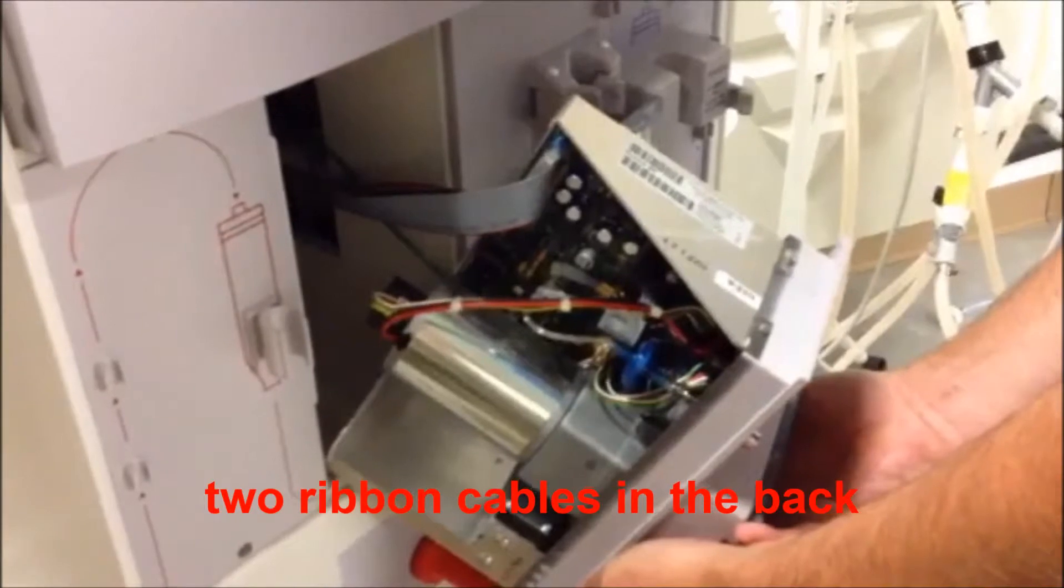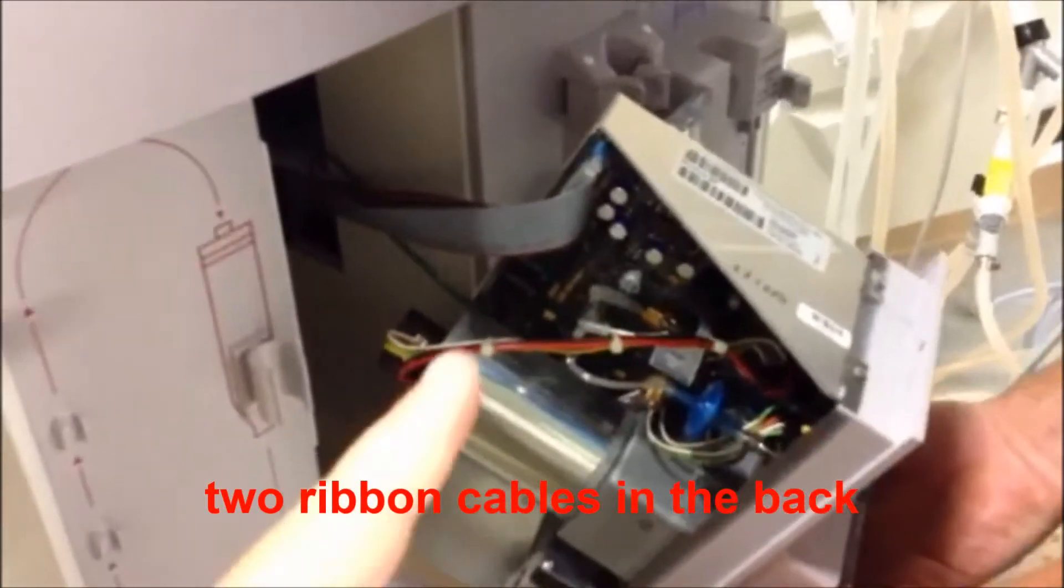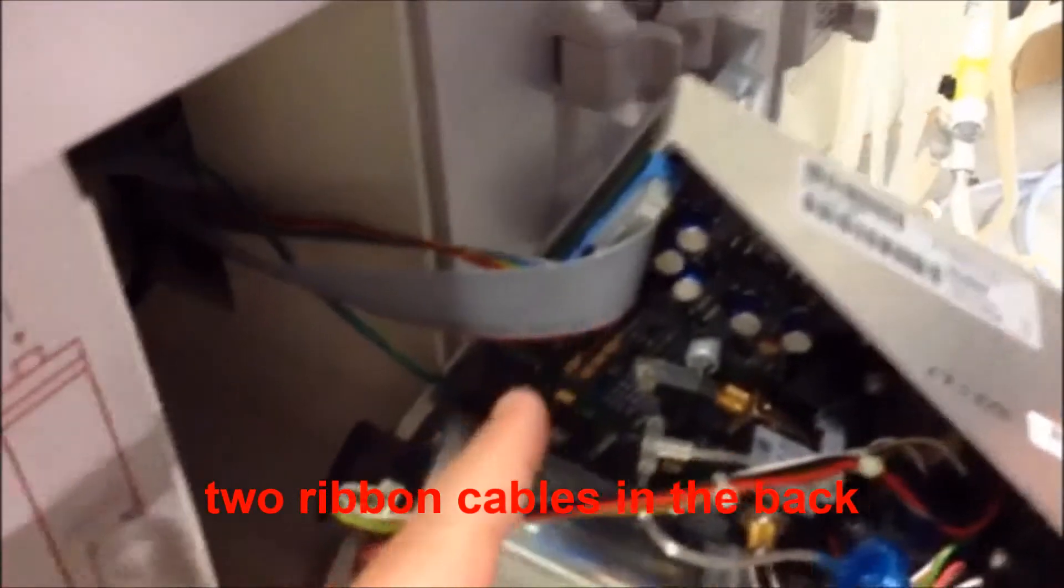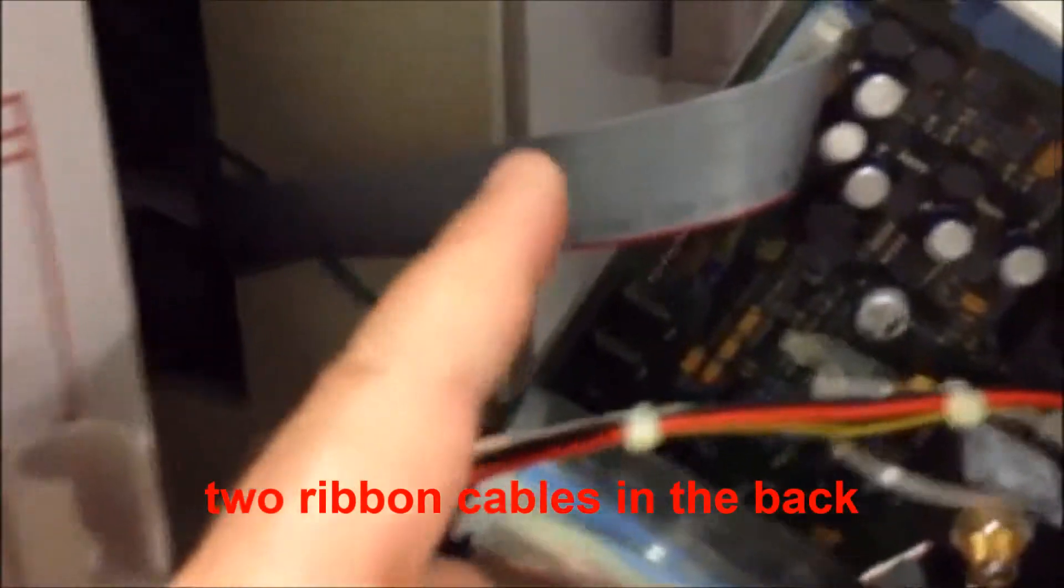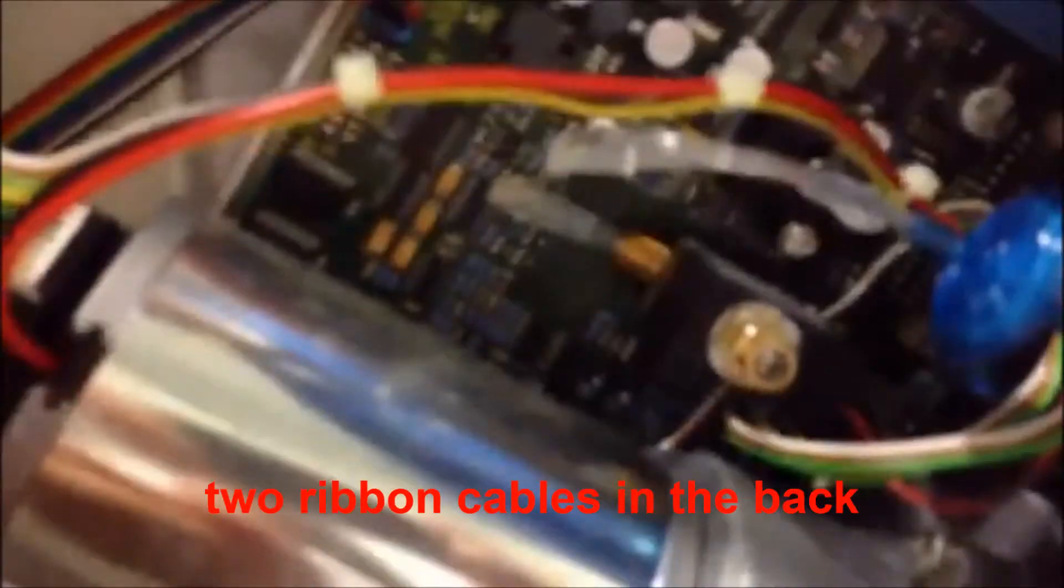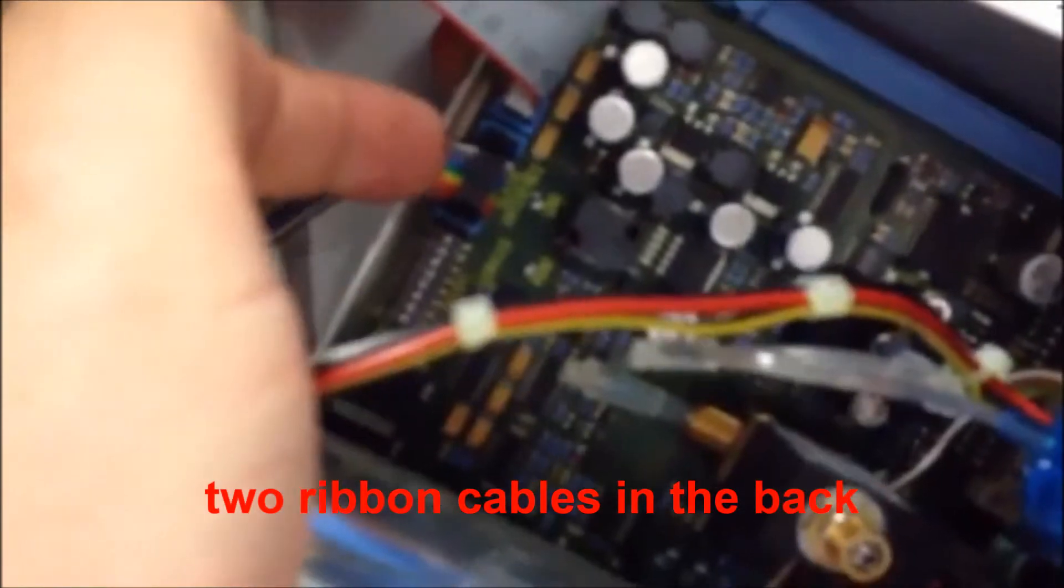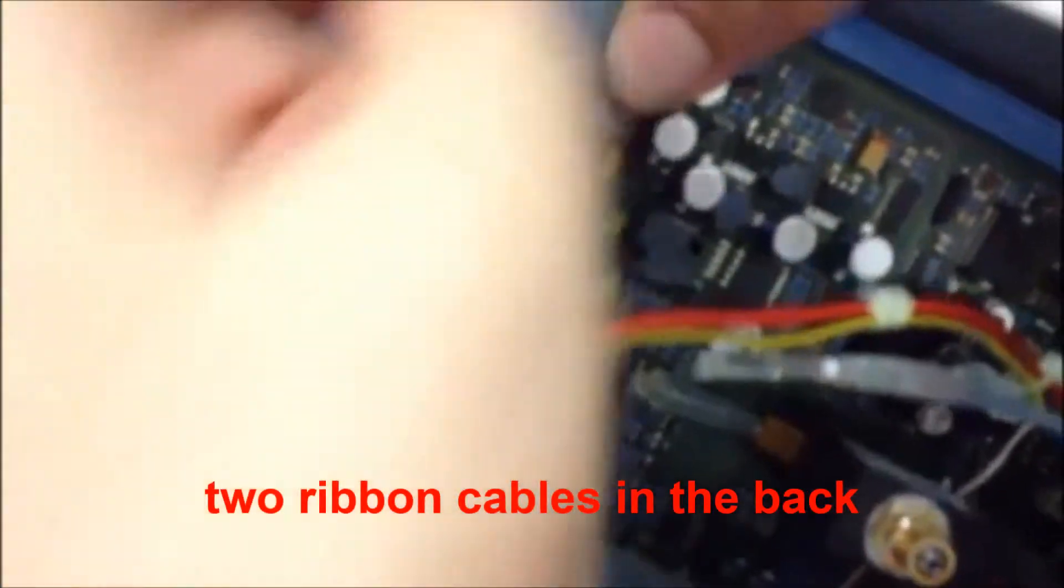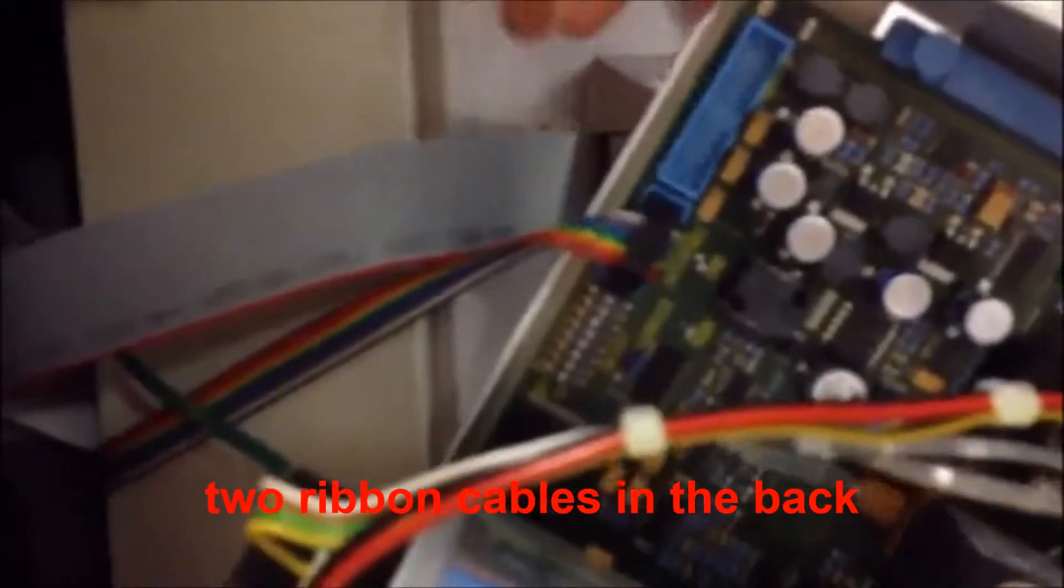There are two ribbon cables in the back that need to be pulled. Here is one, and one is underneath it on the other side. Right here is the second ribbon cable, so these can click and remove. That's one, and this one can be removed as well. Now the whole pump is ready to be removed.